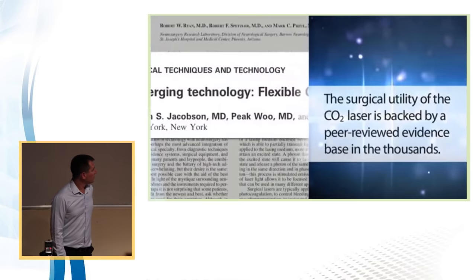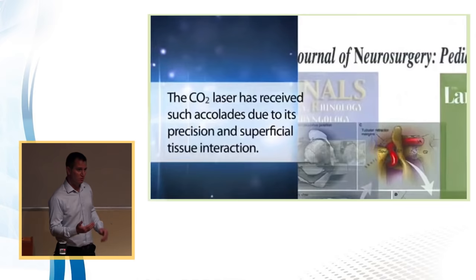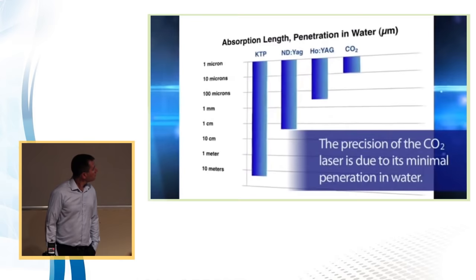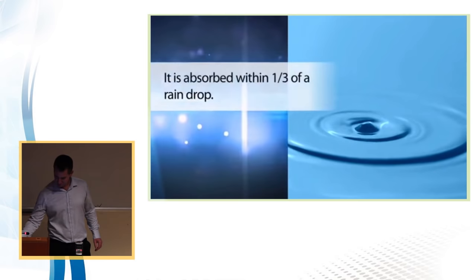If people search in Google for medical application, surgical application, laser, CO2 will rise from a lot of results, because it's used for a lot of applications and is not limited to urology or just aesthetics. It uses the absorption, penetration depth, and everything, because it's absorbing in the water. Here are some applications which are used.